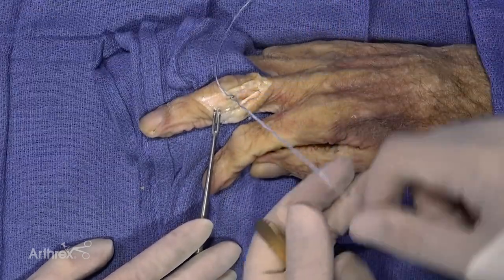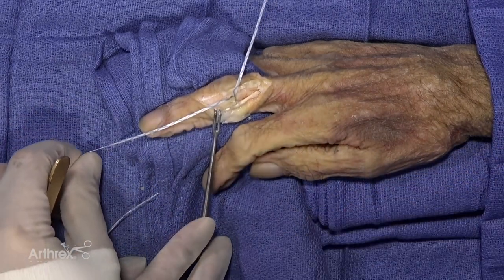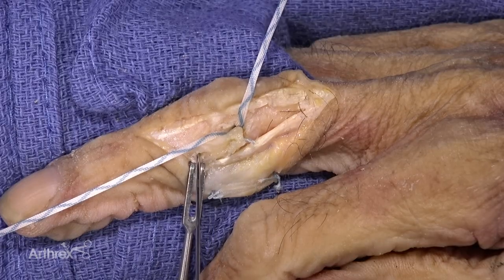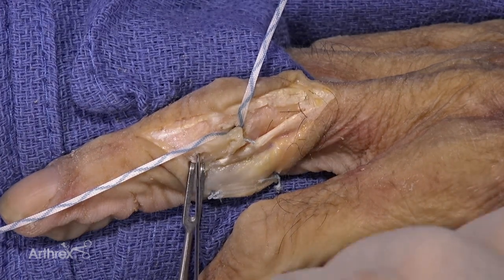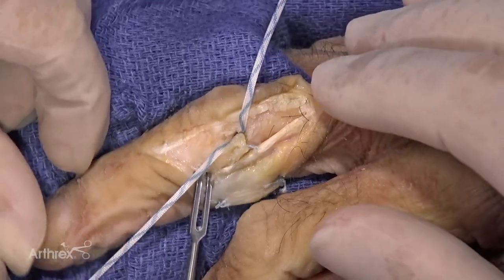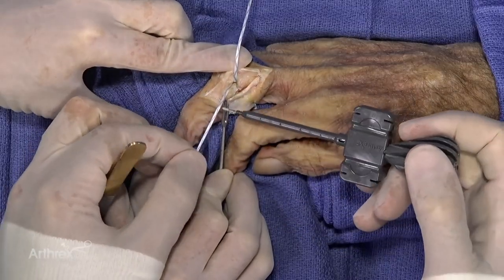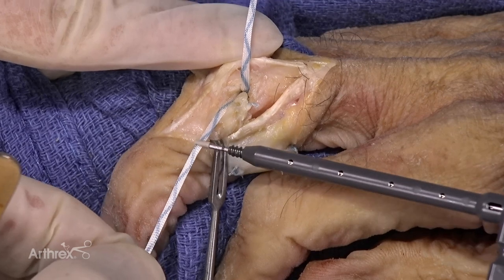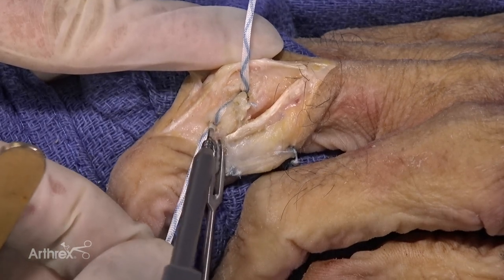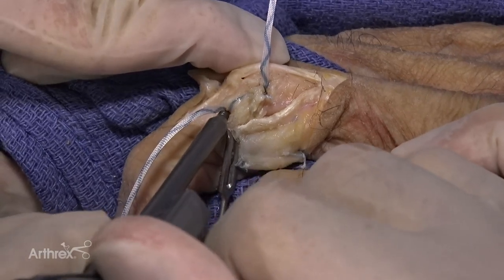So again, we'll use just one limb here, and this is your internal brace component. This is why we've drilled the second drill hole distally. If you're not sure where your hole is, you can re-find that hole by putting your K wire back in. Pretty easy to find right there. So this will be coming right over the top of that for your internal brace. We'll bend that a little bit just to make sure we're not too tight on that. The nice thing about these swivel locks is that they generally will tension themselves. You load it in the eyelet, and it will generally slide in pretty easily for you. Just slow, gentle, even pressure.